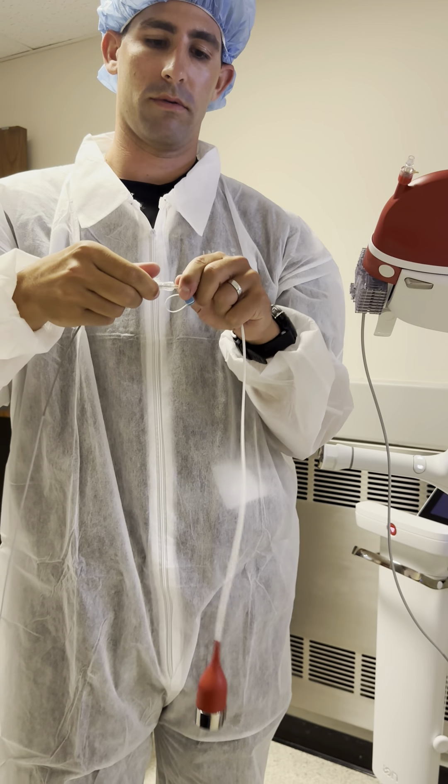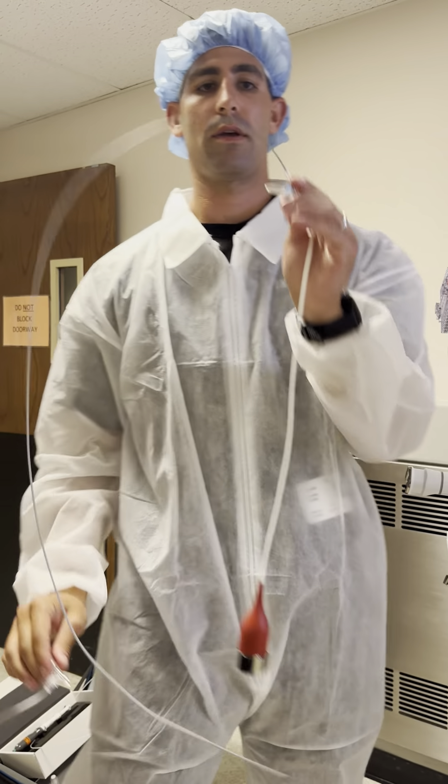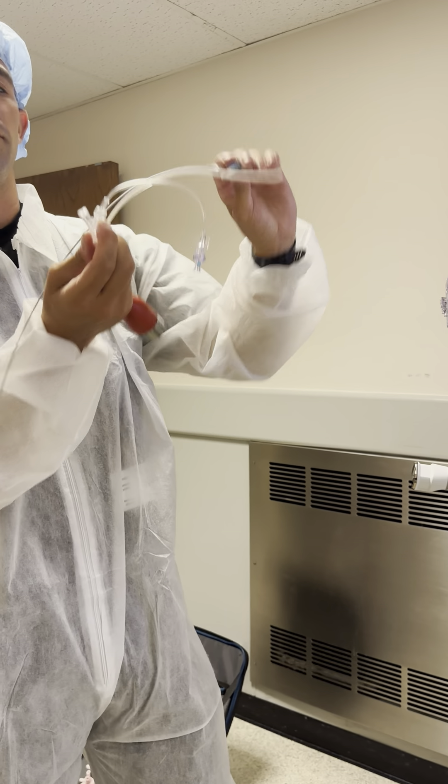I want to unscrew the adapter that I had put on before. This gets tossed. This is going to be reprocessed with Purple Wipes.